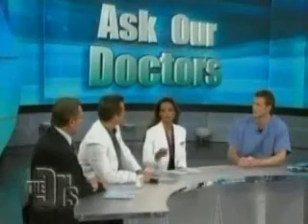And, Jim, you're 99%. It's very scary as a parent. So it's good to have something sometimes, and this is very portable, and you can just throw it on if you're not sure, and it can help you decide if you need to go. I think it's better to just look at your kid. Yes. Are they working too hard to breathe? Christina, you probably know that, as a parent with a child with asthma, you learn to see the signs. You know when they're okay and when they're not.